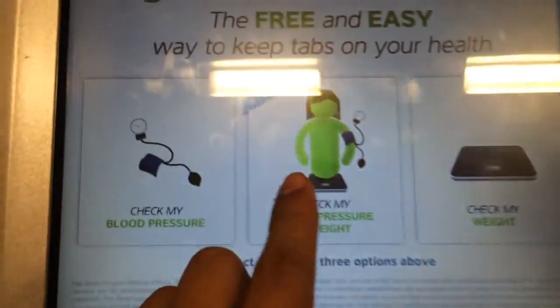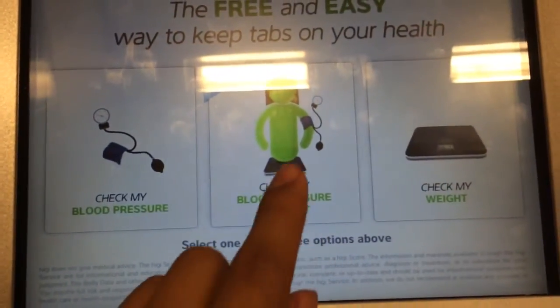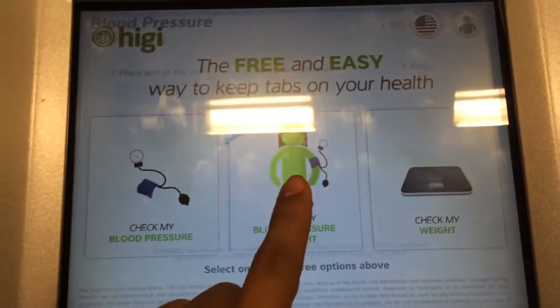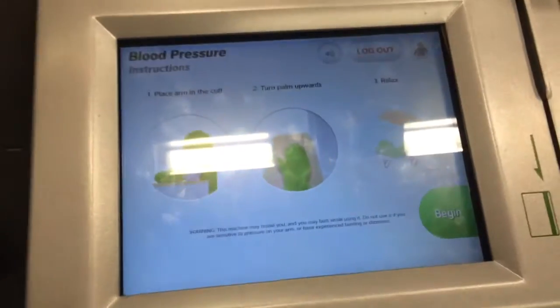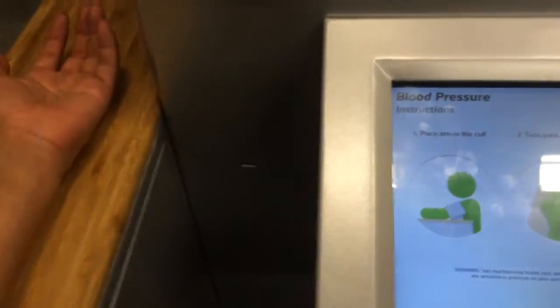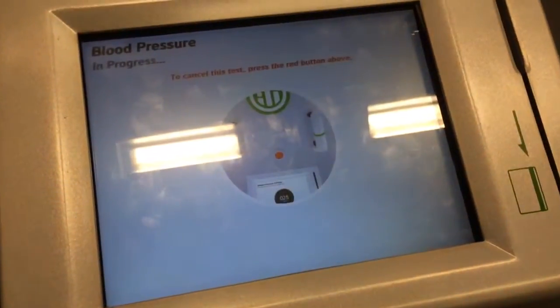So I'm going to do both — check my blood pressure and my weight today. Let's check your blood pressure and pulse. Place your left arm in the cuff. Turn your palm to the sky. Relax and breathe normally. Press begin to get started. If you'd like to cancel this test at any time, press the red stop button above the screen.